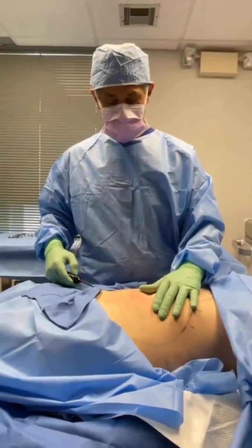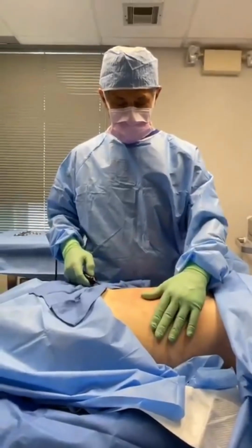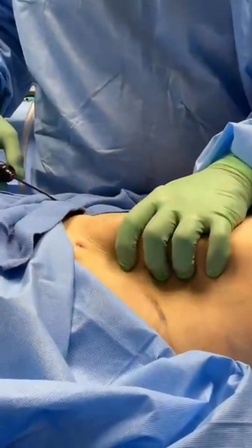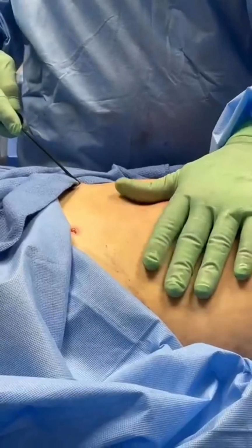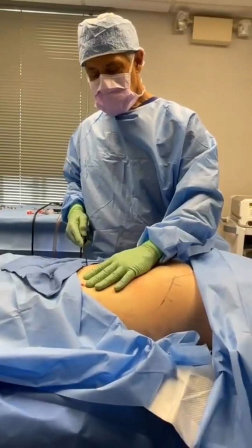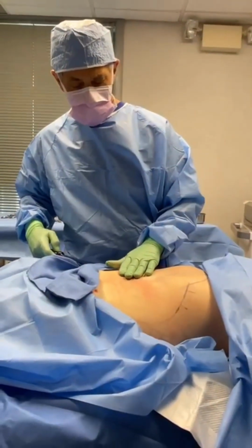I'm going to lay down a little bead of plasma energy. So you felt a little pinch? A little pinch, yeah. Okay. It spooked me more than it hurt. Okay, spooked you, all right. And you can see this kind of puffed up in here when I did that. I don't know if you can hear this, but there's some gas that I'm able to squeeze out through the little poke holes here. That's the helium gas that we ignite into a plasma with radio frequency energy. And it comes out on purpose through our little poke holes. So this is Renuvion tightening energy.